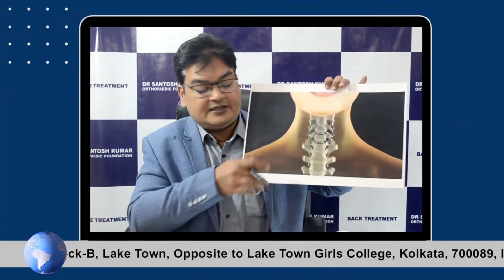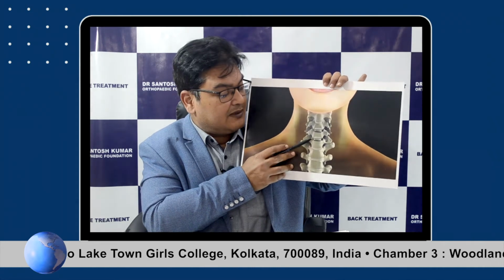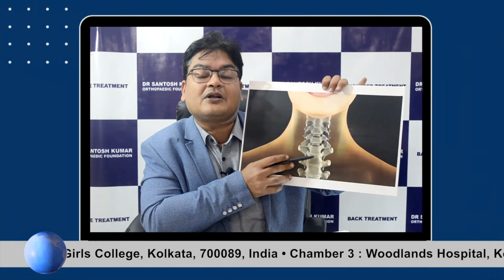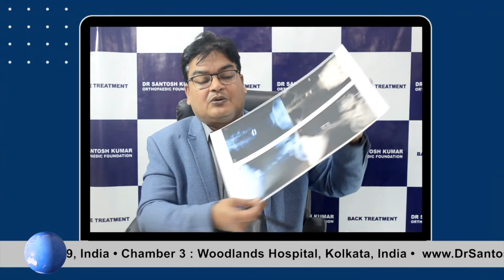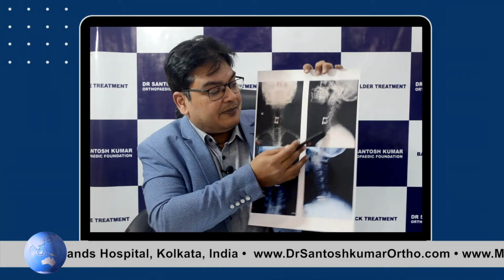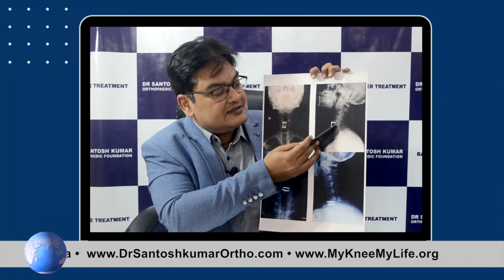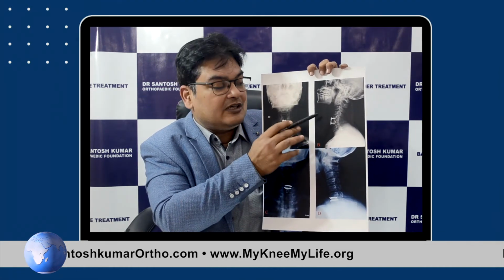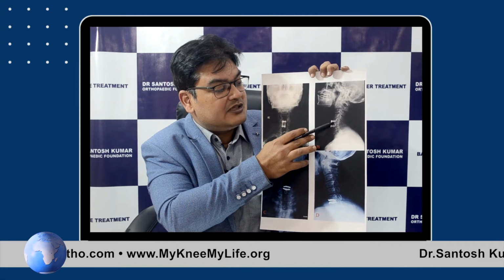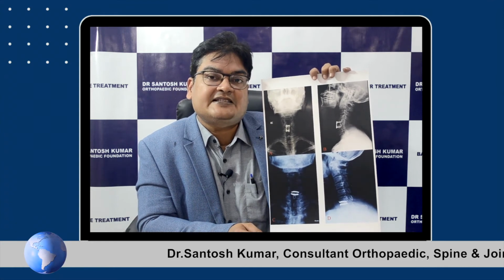In this photo, we can see the diseased disc material has been replaced by a prosthetic, artificial disc, which is known as cervical disc replacement or disc arthroplasty. So in X-ray, we have compared that in the upper X-rays, fusion has taken place in which the diseased disc, which is the jelly between the 2 vertebral bones, has been removed, a cage has been put and a plate has been fixed. So this is known as anterior cervical discectomy and fusion or ACDF.